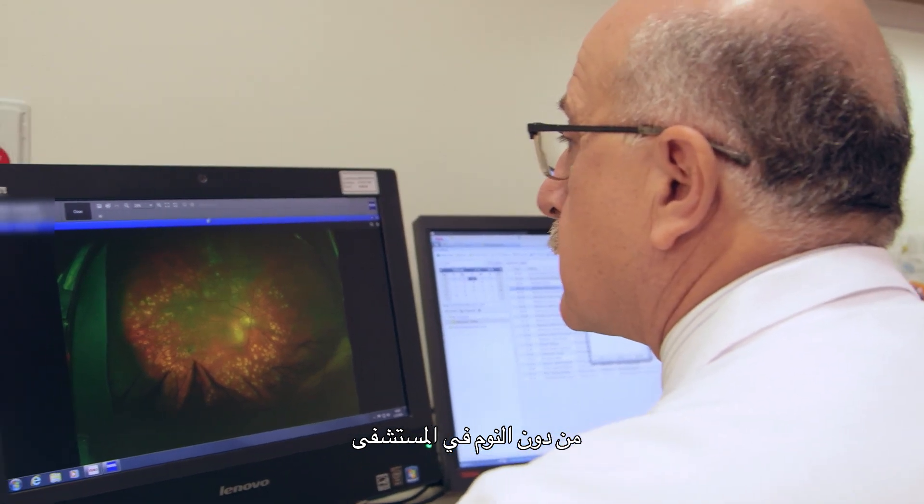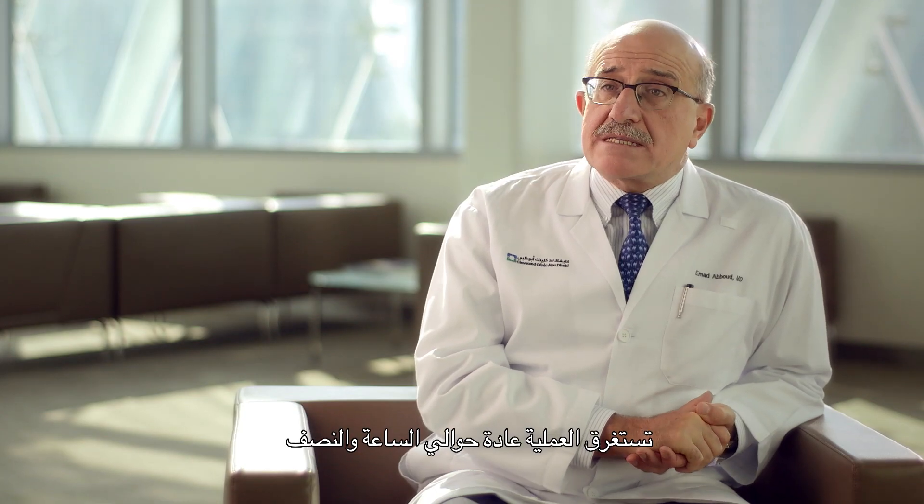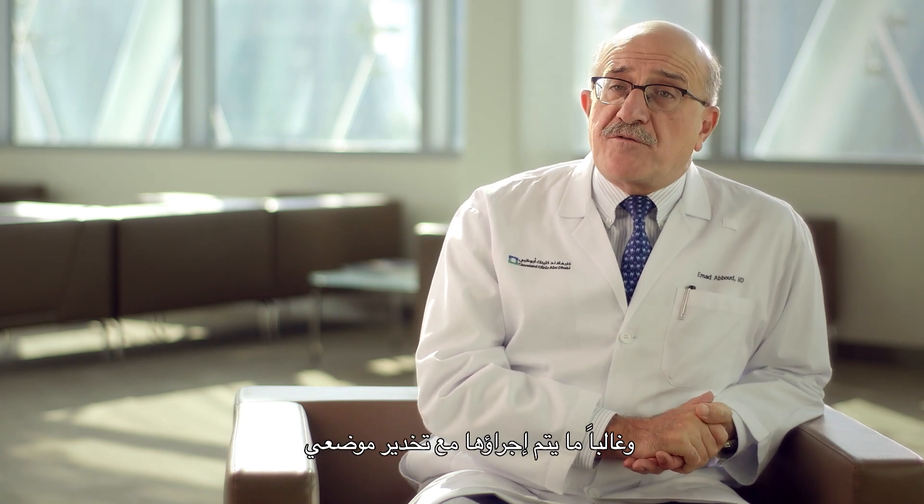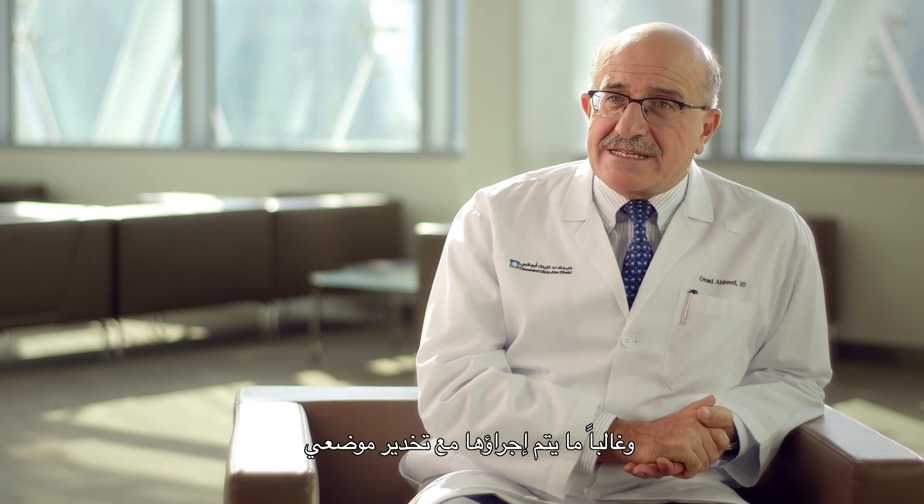Vitrectomy, like most eye procedures, is performed on an outpatient basis. The procedure takes on average one and a half hours and is mostly performed under local anesthesia.